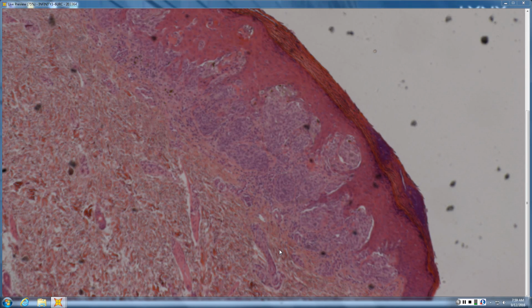In terms of immunostains, HMB does work on these. MIB is helpful in these. And another one that's helpful, S100A6, is strongly chocolate brown positive all through Spitz nevi, and weak and patchy in melanomas. Caution when you get to the pigmented spindle cell nevi, those small cell ones that are all spindle cells on the legs of women and trunk of young men. They stain like melanoma, weak and patchy. Any small Spitz cell stains weak and patchy. It's the big Spitz cells that stain strongly with S100A6. So like with anything else, you just have to know your stain in order to use it appropriately.